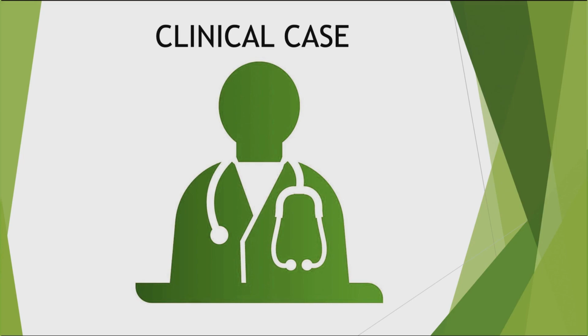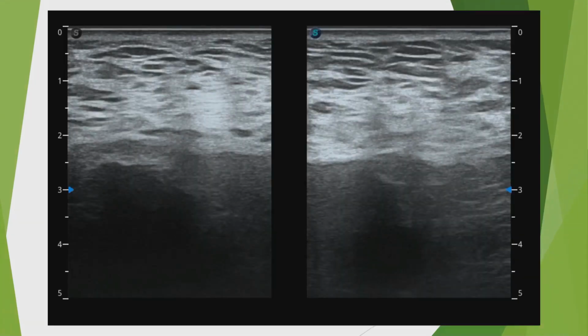So the ultrasound machine is always ready next to the patient. So I pull out the ultrasound probe, and this is the image I get. I'm sure you'll agree that this is catastrophic. I tried to adjust the image, I tried to improve, but very clearly, the image depth and echogenicity of this 73-year-old patient make that, overall, you don't get much out of this ultrasound, so musculoskeletal equals high frequency.